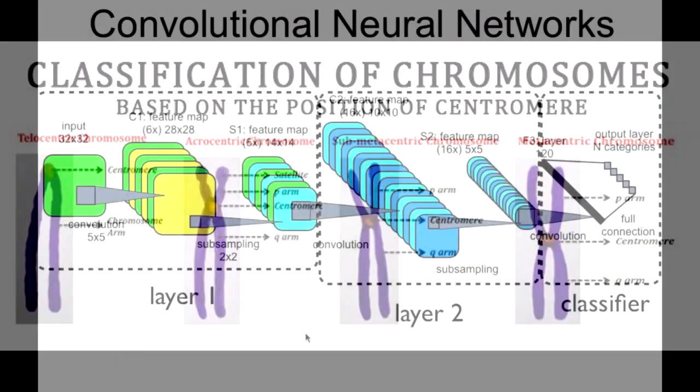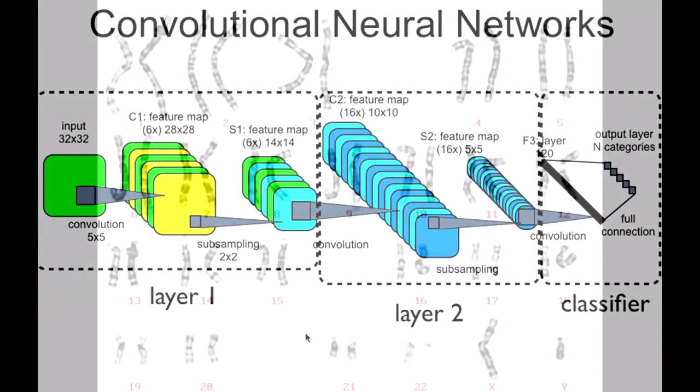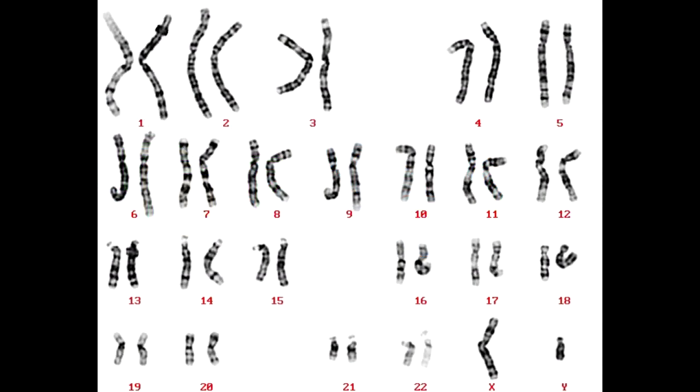Next, we come to classification, which resembles the likelihood of class membership and assigning a class to each of the segregated chromosomes. Different types of classifiers like distance and statistical, nearest neighbor, fuzzy, and neural network based techniques have been developed. Among all the classifiers, neural networks are the most popularly used because the model adjusts and learns to different types of databases provided. The final stage includes a graphical representation of the ordered chromosomes.